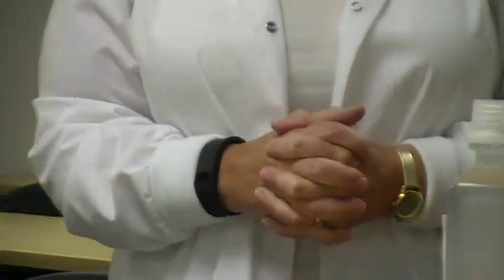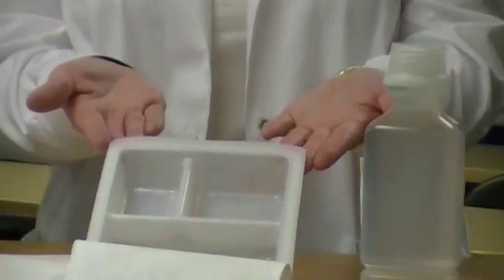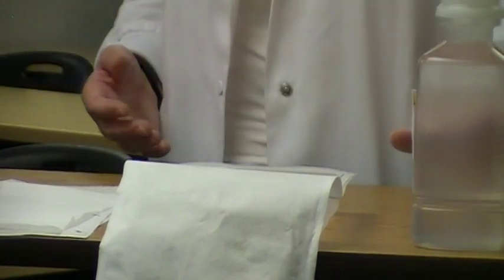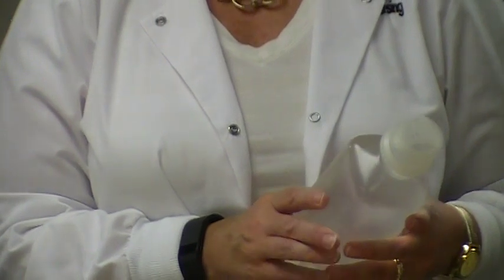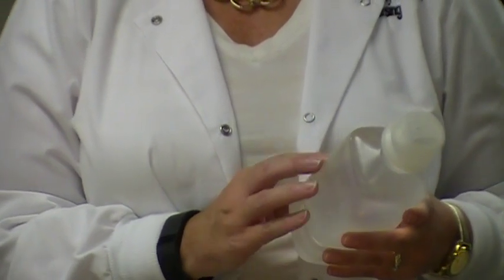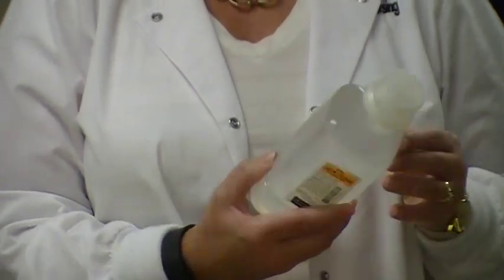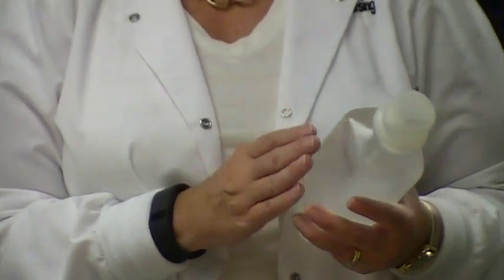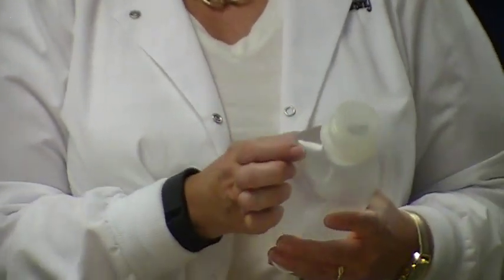The next thing that we need to do is go ahead and pour our sterile solutions into our tray. If you look at our tray, it has 3 compartments. So we want liquid in all 3 compartments. So the very first thing that we're going to do is we're going to pick up our solution. We're going to make sure that it is the prescribed solution, and also that the expiration date has not passed. We're going to make sure that there's no particles, anything in here that shouldn't be. So I see that this is normal saline. The expiration date's June the 1st of 2016, so we're still in good compliance with that.